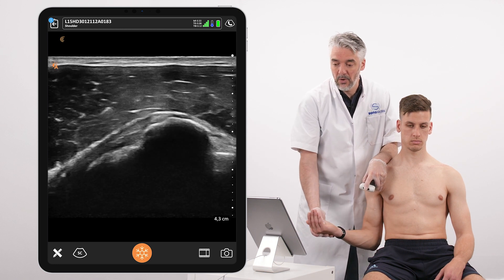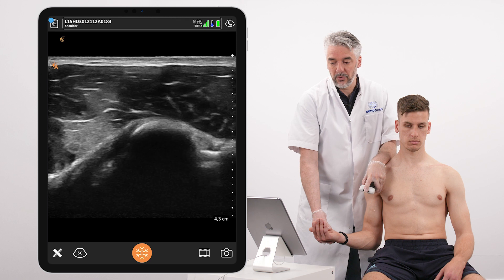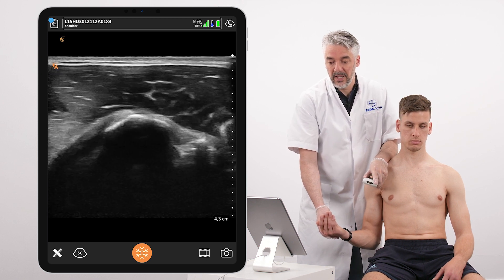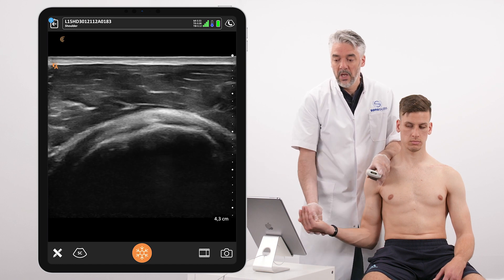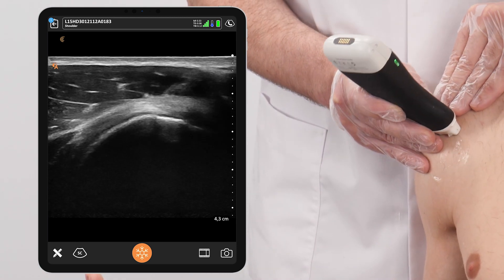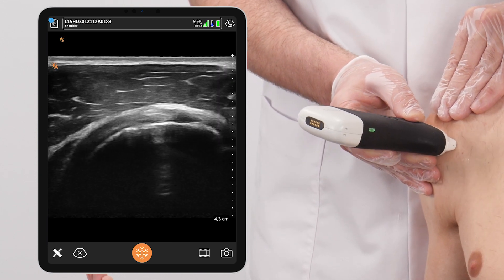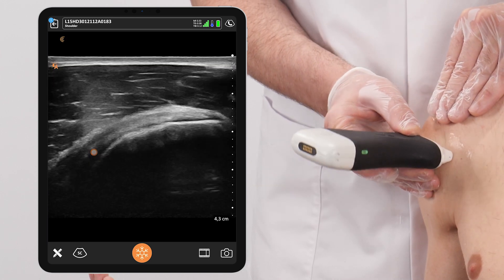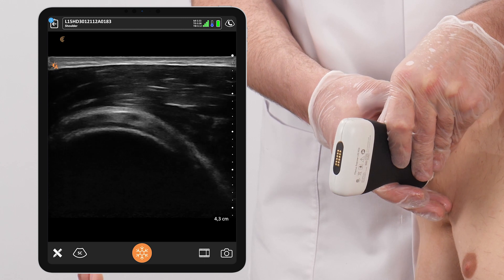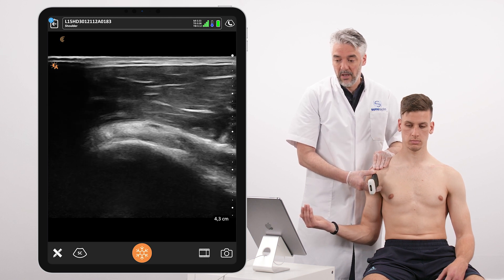From here we're going to follow the subscapularis tendon. First in 45 degrees of external rotation, we look at the insertion to the lesser tubercle — this insertion looks fully intact. Then we externally rotate the arm towards 90 degrees and follow the full tendon from proximal to distal to assess not only the tendon quality but also the cortical bone quality and the overlying subacromial subdeltoid bursa. This is done in both long axis and short axis planes, making sure to visualize every part of the subscapularis as it is a very large structure.